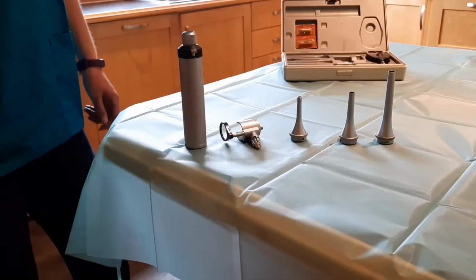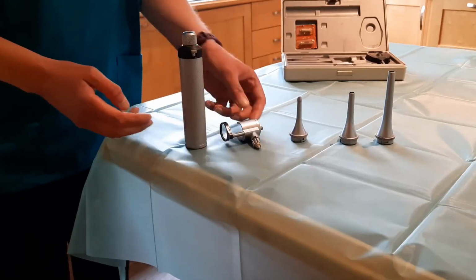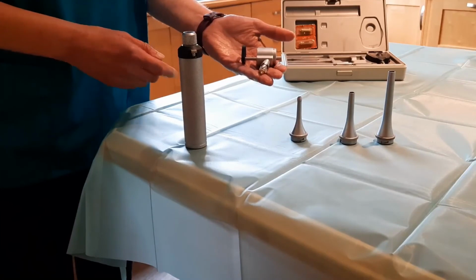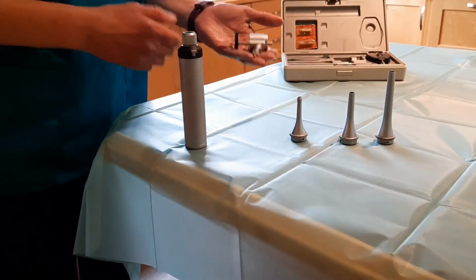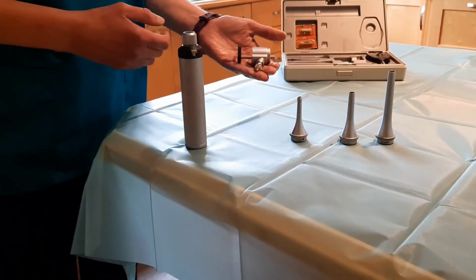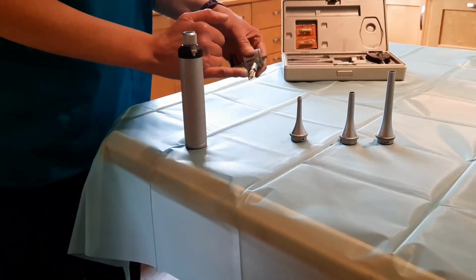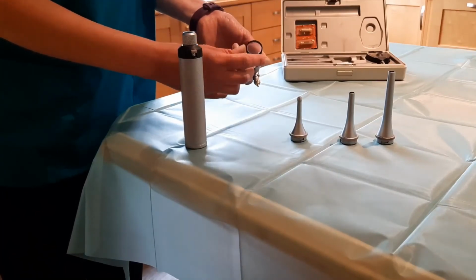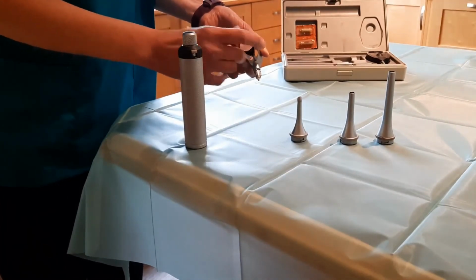To examine the ear, we use an otoscope. So again, it's the same power base, but this time we'll attach it to an otoscope head and use one of a series of specula or cones, depending on the size and shape of the patient's ear. So the otoscope head has a bulb, the light is emitted here, and this is a magnifying lens which gives a good view of the ear canal, and it can be moved to the side as necessary.